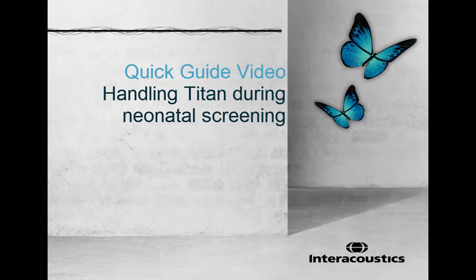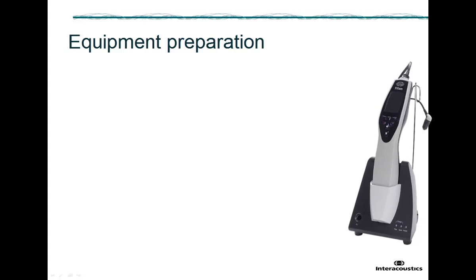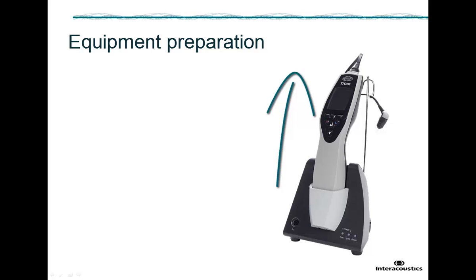This quick guide video shows how to prepare and handle Titan when used for neonatal screening. Firstly, take Titan from the cradle and check if the correct cables are connected.